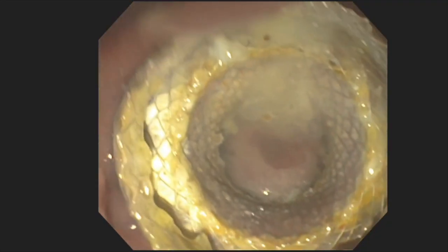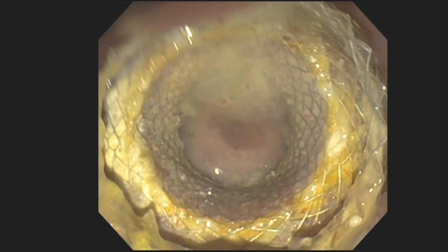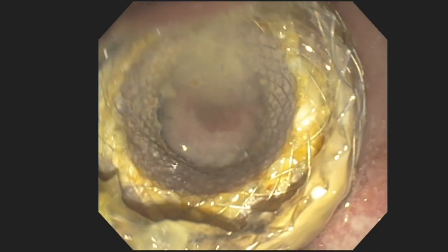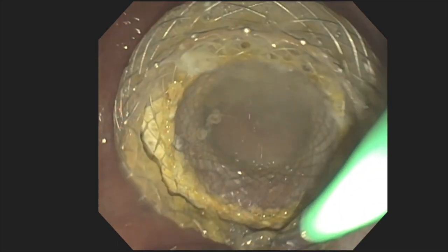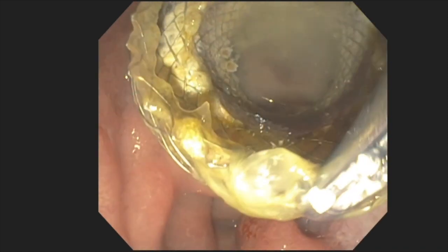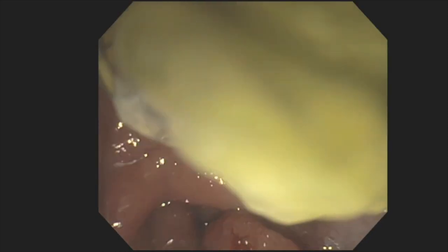This 54-year-old female with history of acute necrotizing pancreatitis had undergone EUS-guided drainage of a walled-off necrosis by the transduodenal route using a lumen-apposing metal stent. CT scan performed 3 weeks after stent insertion showed a complete resolution of the walled-off necrosis, and therefore the lumen-apposing metal stent was removed.